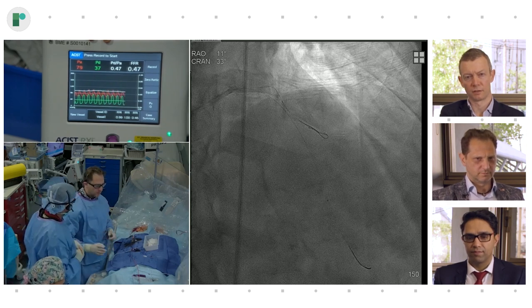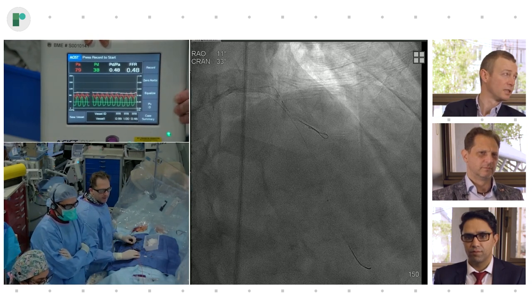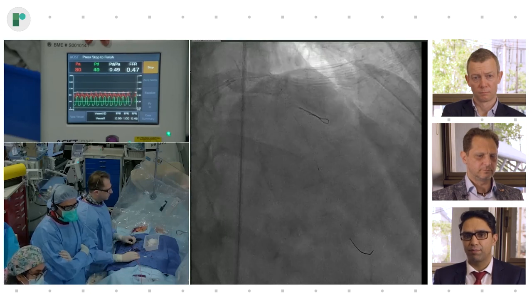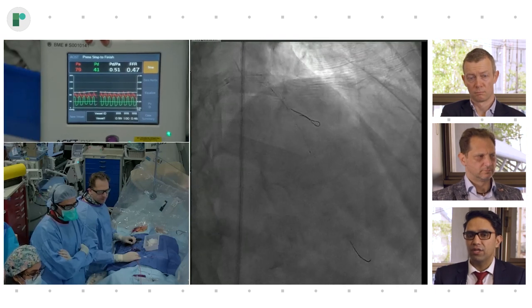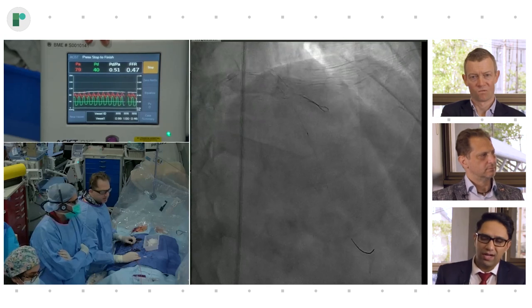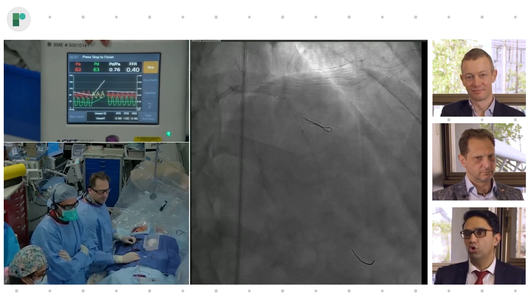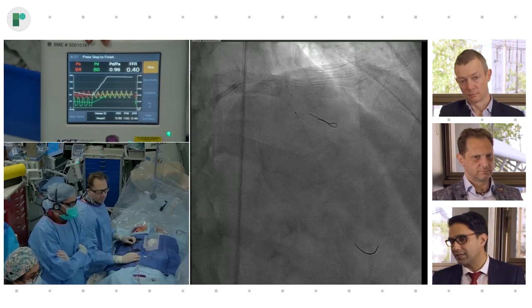That's highly significant, right? So this is likely a tight lesion, which may be slightly overestimated because of the profile of the Navvus catheter. Of course, we studied that in the PERFORM study, which showed that the microcatheter does impact by a mean difference of about 0.03. But one of the things we've learned since then is that we're, to be honest, moving away from the cut point. Is there really that much difference between 0.79 and 0.81? What we're doing is using the physiology data in conjunction with all the patient's symptoms and what the anatomy's like, to help us make decisions.